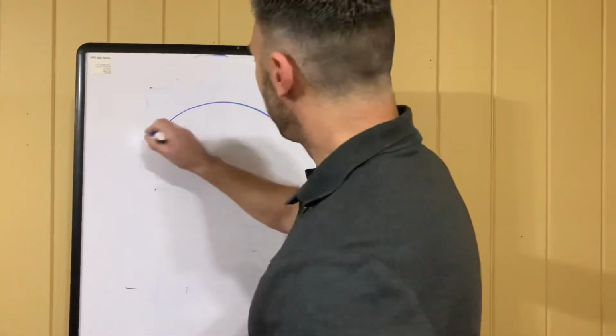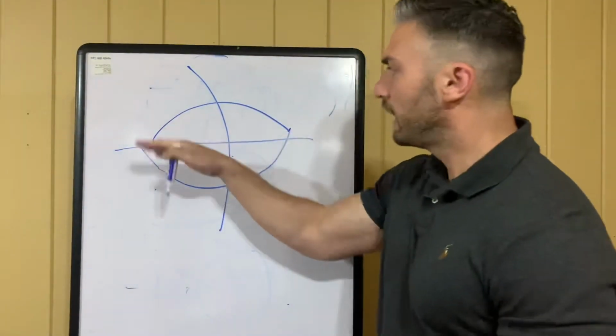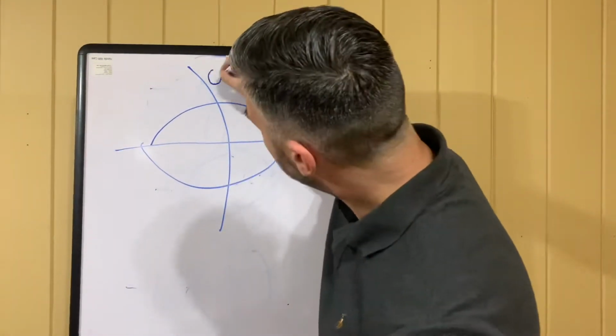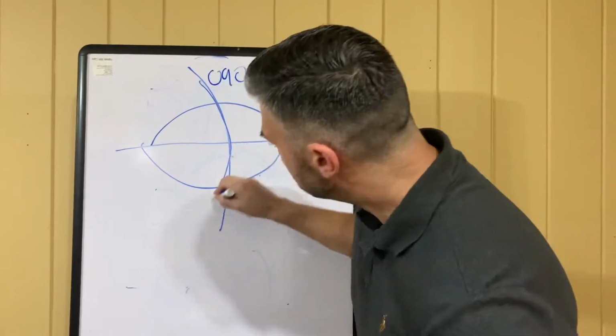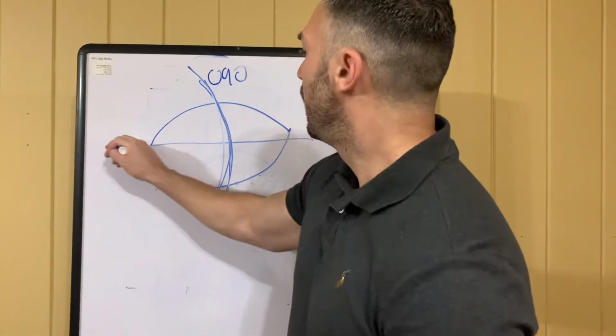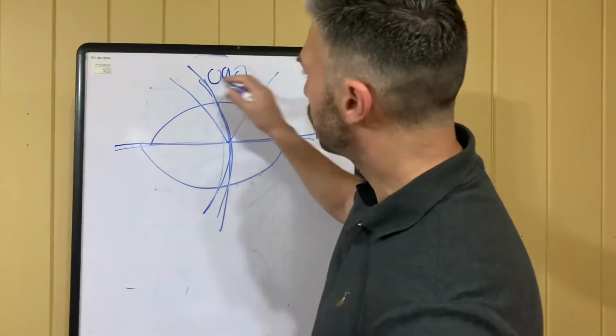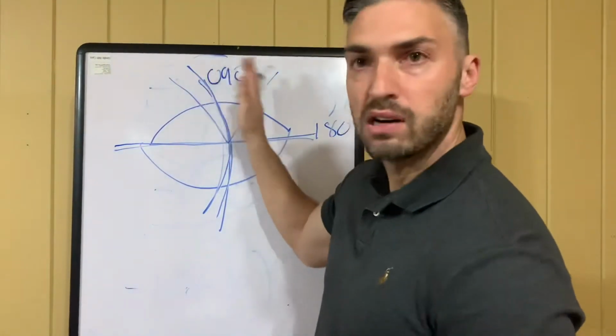It's important to be able to recognize what with the rule and against the rule astigmatism looks like. With the rule astigmatism, you could think of as a football laying on the ground, where that 90-degree meridian is the steepest. So it's going to be your strongest power on the 90 and your flattest on the 180. Or it could be within 30 degrees of that and still be considered with the rule.